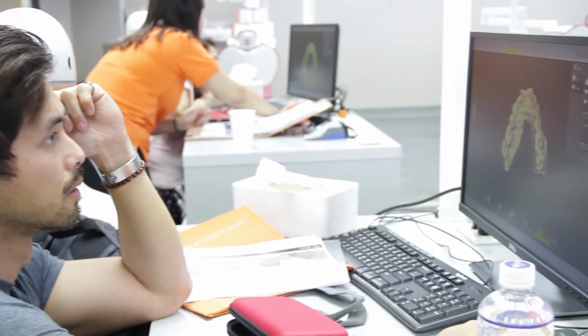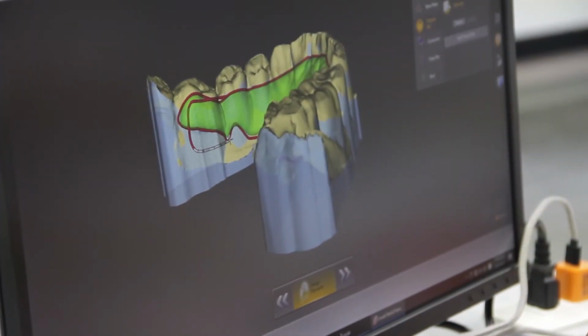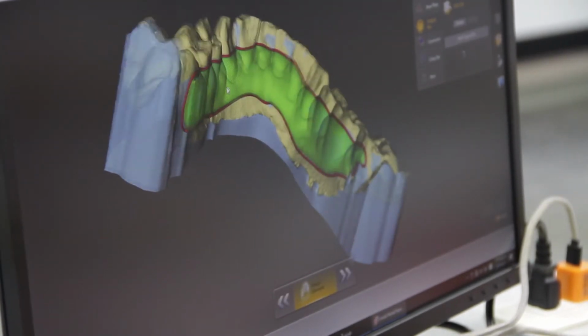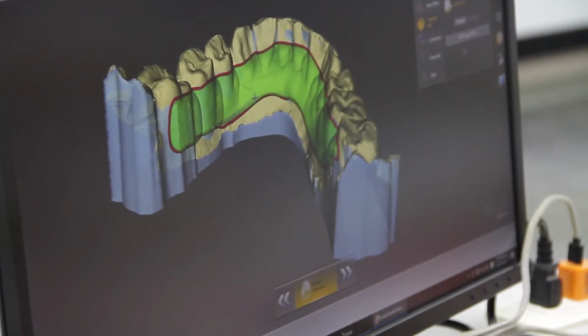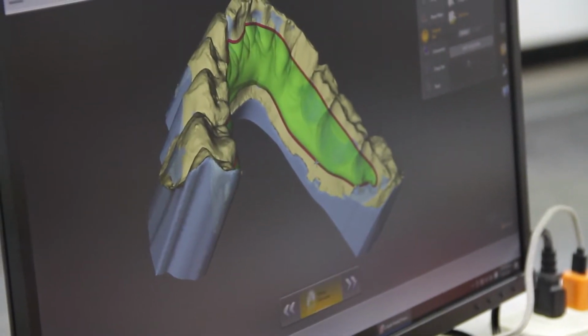But this is the first course ever where I learned how to use it in a digital way with technology assistance, especially with the CCAT functional. So we can get these parameters applied into our CEREC machine. Then this actually answers our questions when we do our occlusion design with the CEREC, and how we propose a restoration. And this is quite an essential part, especially for full-mouth rehabilitation cases.